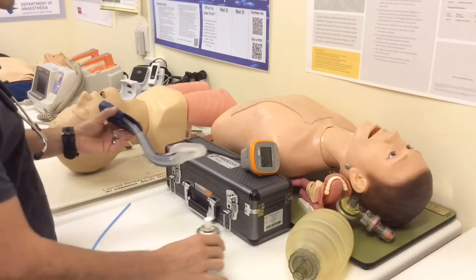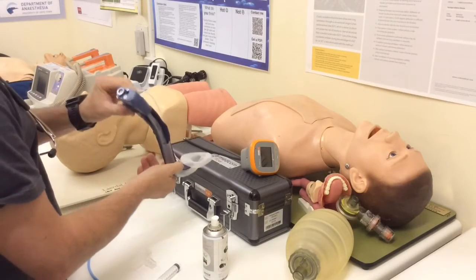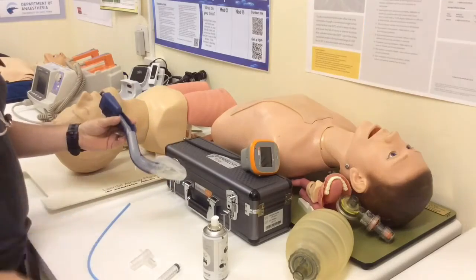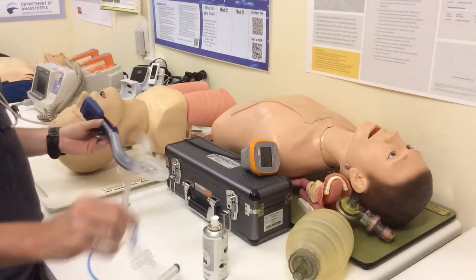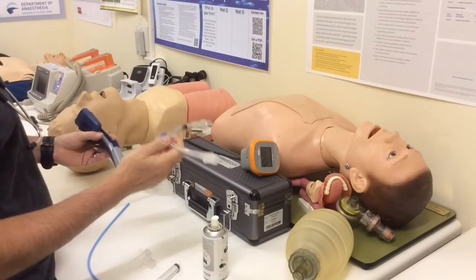And what you see is missing here is any kind of stem to connect my laryngeal mask to my ventilation. And that is because the one thing that's not in the blister pack is an appropriately sized endotracheal tube for your patient. You've got to select that based on the patient that's in front of you.